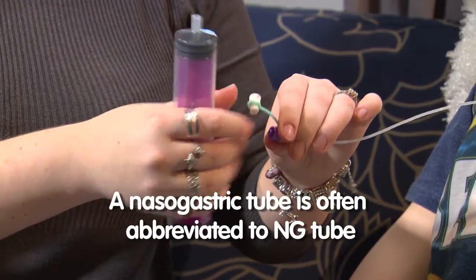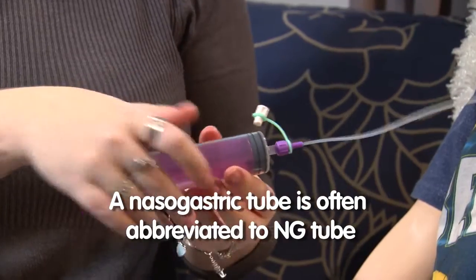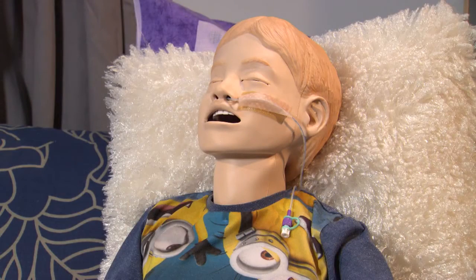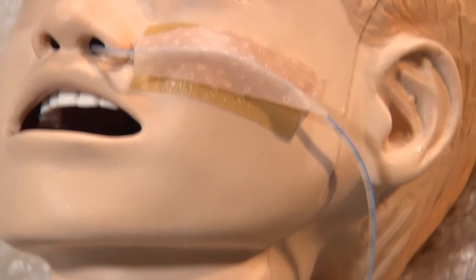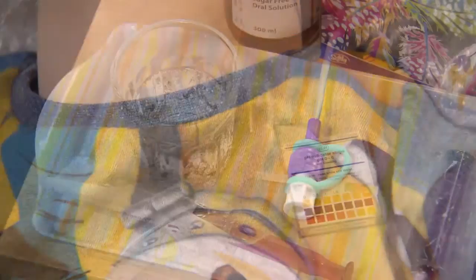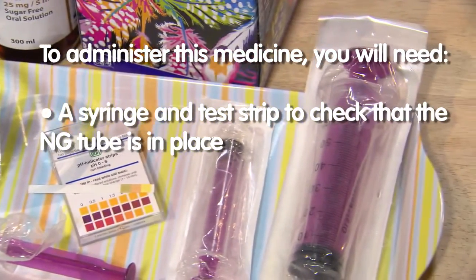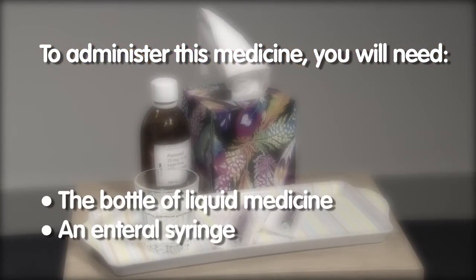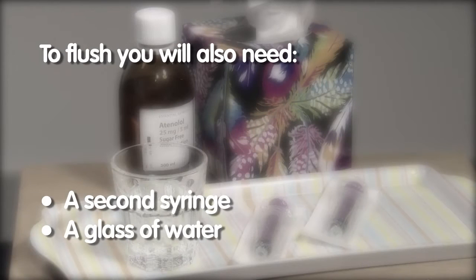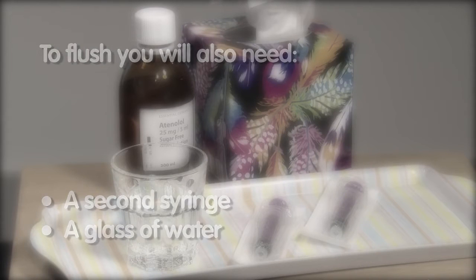A nasogastric tube is often abbreviated to NG tube. You should watch the film all the way through to the end before giving the medicine for the first time. To administer this medicine you will need a syringe and test strip to check that the NG tube is in place, the bottle of liquid medicine, and an enteral syringe. To flush the tube first, you will also need a second syringe and a glass of water.